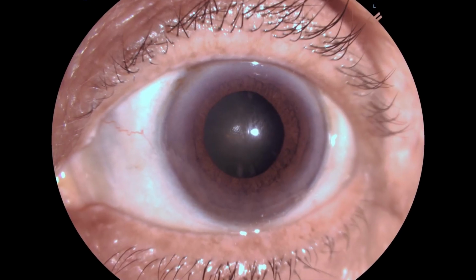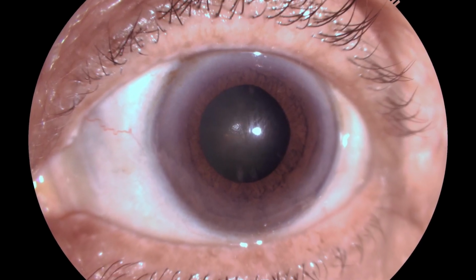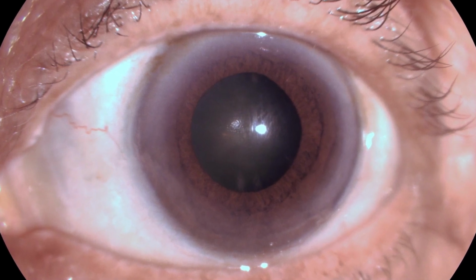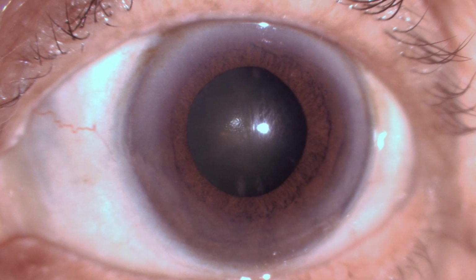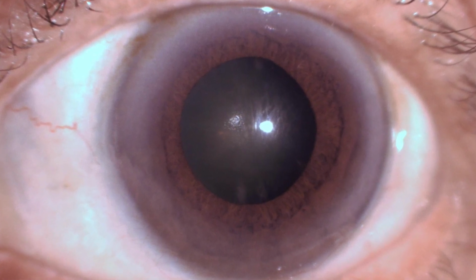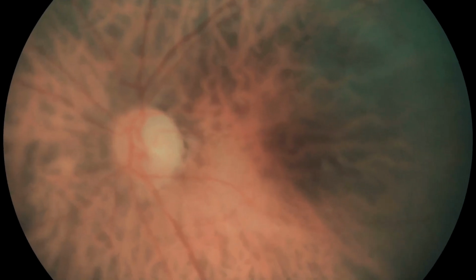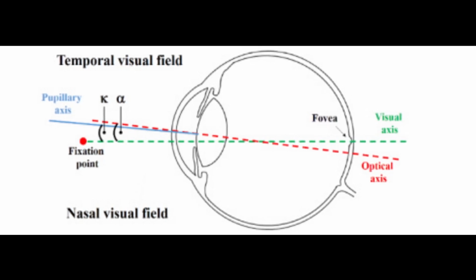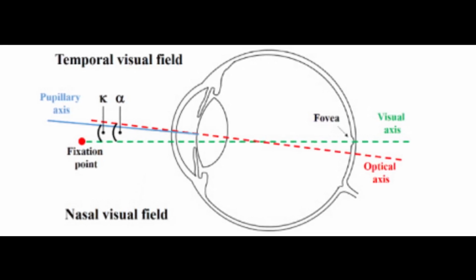This is one patient who wanted to get rid of glasses and was planned for cataract surgery. And one peculiar thing which we can see here is that the pupil is not very well dilated in spite of mydriatic eye drops. This is the fundus, which is apparently normal with few tessellations. And these are two issues which we should understand when we are implanting multifocal IOLs.